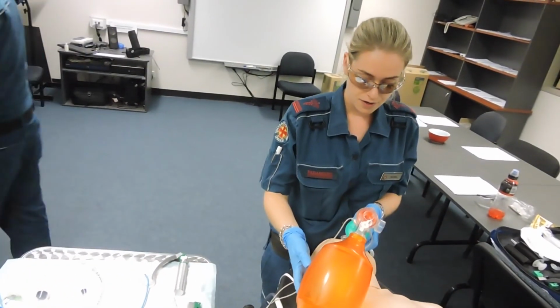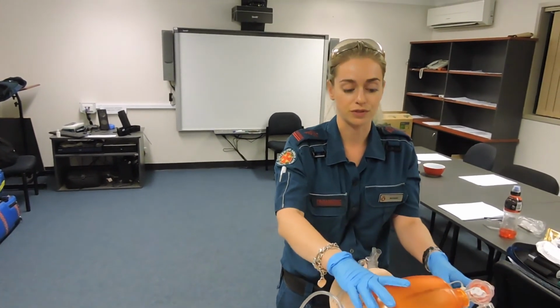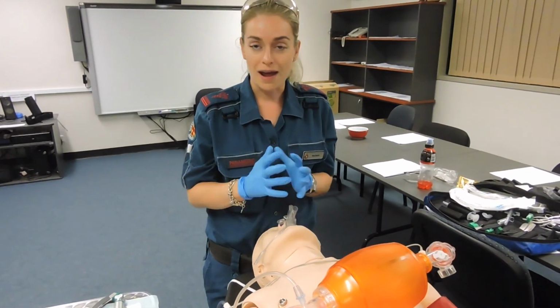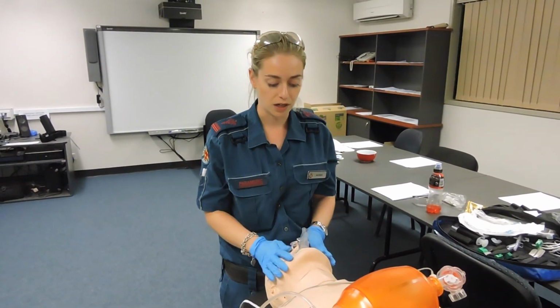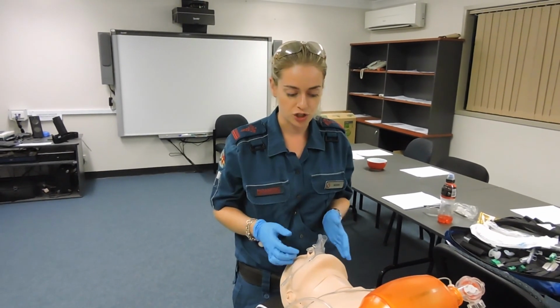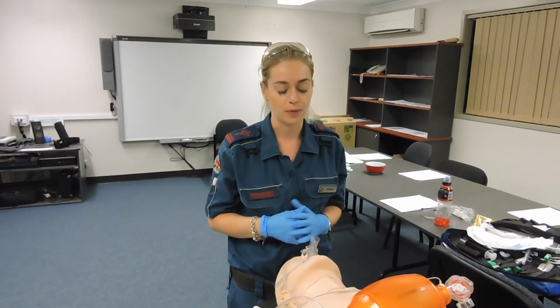Okay. So that's a demonstration of a failed intubation drill, where the importance of understanding what steps you're going to take in a can't intubate, can't ventilate situation is of the utmost importance. To just reiterate to you, it's all about managing your airway with the resources that you have, using your oropharyngeals and your nasopharyngeals, a 2-person BVM technique as in the beginning, utilising your LMA and optimising your patient position, using your bougie, and attempting to maximise this as much as possible, including laryngeal manipulation.